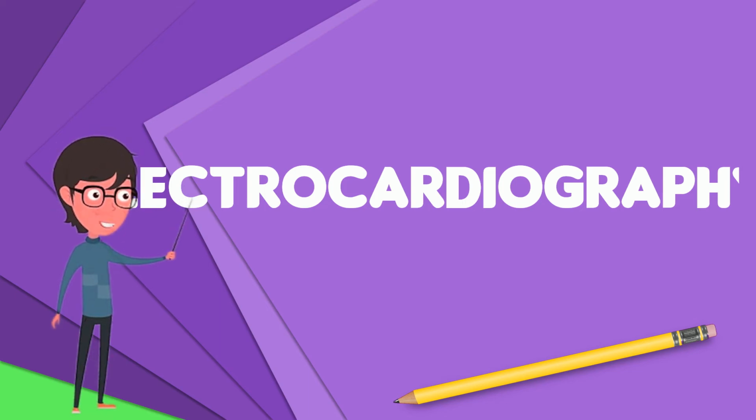To the trained clinician, an ECG conveys a large amount of information about the structure of the heart and the function of its electrical conduction system. Among other things, an ECG can be used to measure the rate and rhythm of heartbeats, the size and position of the heart chambers, the presence of any damage to the heart's muscle cells or conduction system, the effects of heart drugs, and the function of implanted pacemakers.